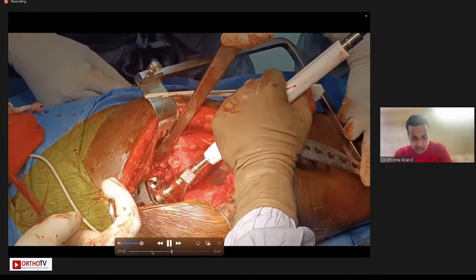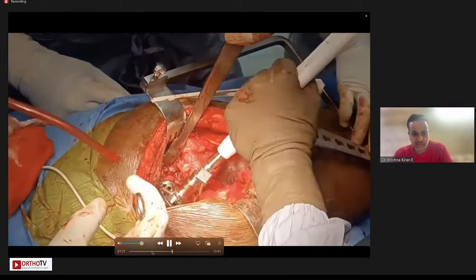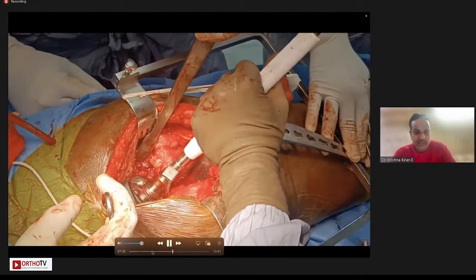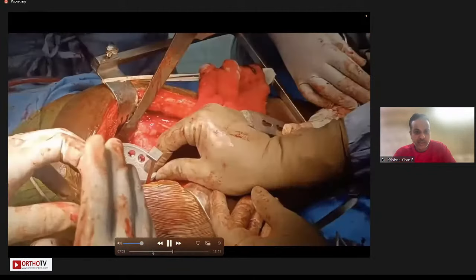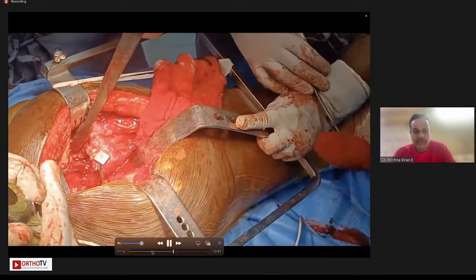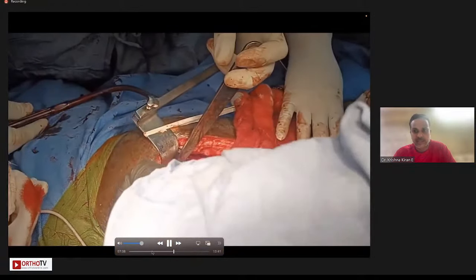Now, once we are sure that the size of the socket is around 64 or 62 or whatever is the size which is best engaging into the AP capture, now you use this shell. This is the Redapt shell. You can see there are two screws in the periphery which will engage into the superior pubic ramus and two screws which will engage into the ischium.